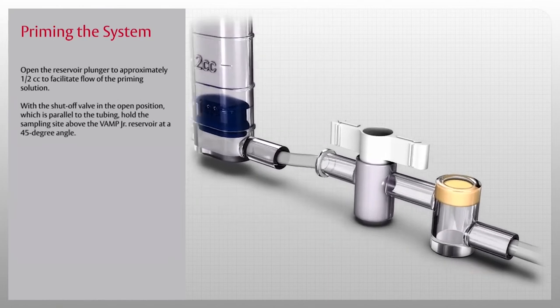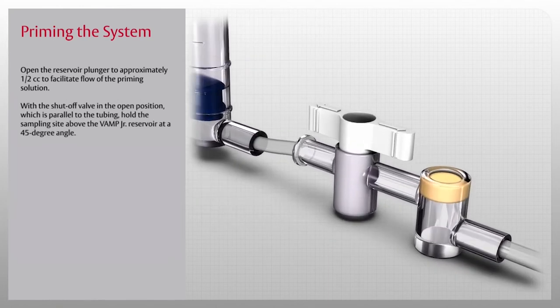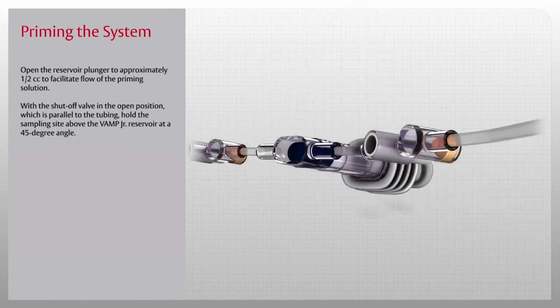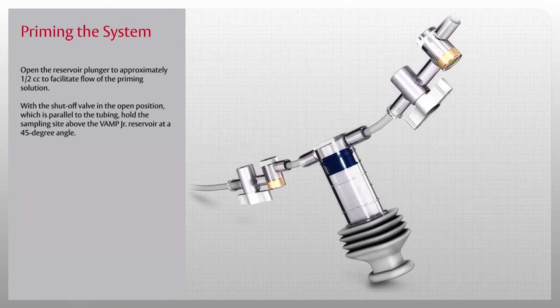Next, with the shutoff valve in the open position, which is parallel to the tubing, hold the sampling side above the Vamp Junior reservoir at a 45 degree angle.